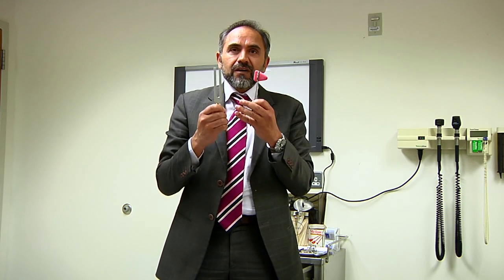But one of the problems with this approach is that this is very much person or physician dependent, and therefore there's a lot of variability, and we actually can't really establish a grade of neuropathy. All we know is whether it's normal or abnormal.